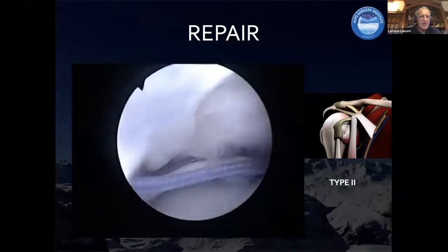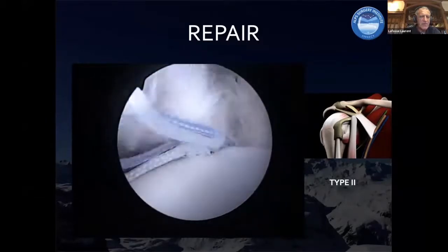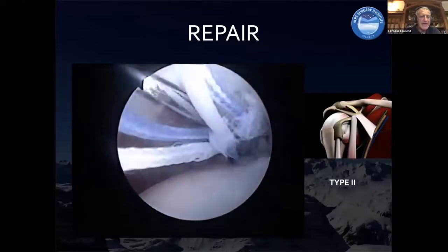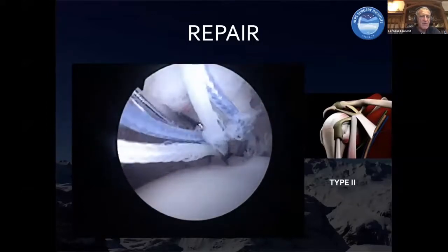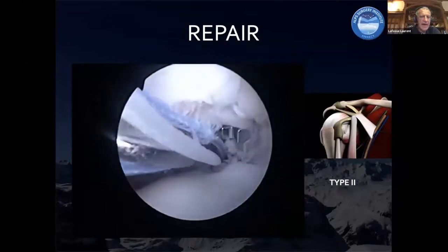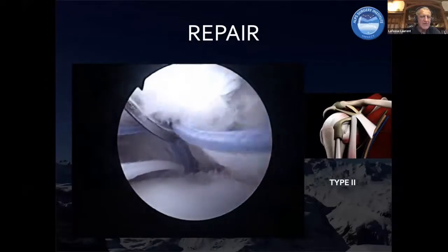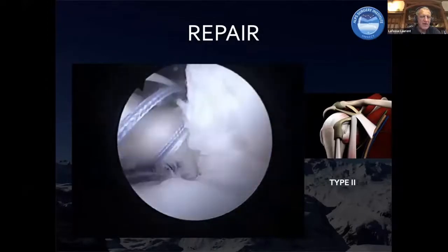And it's important to keep the rotator interval open post-op. But you see that here we can repair the tendon without trying to repair the capsule, or we can bring the capsule and the tendon back to their own place.